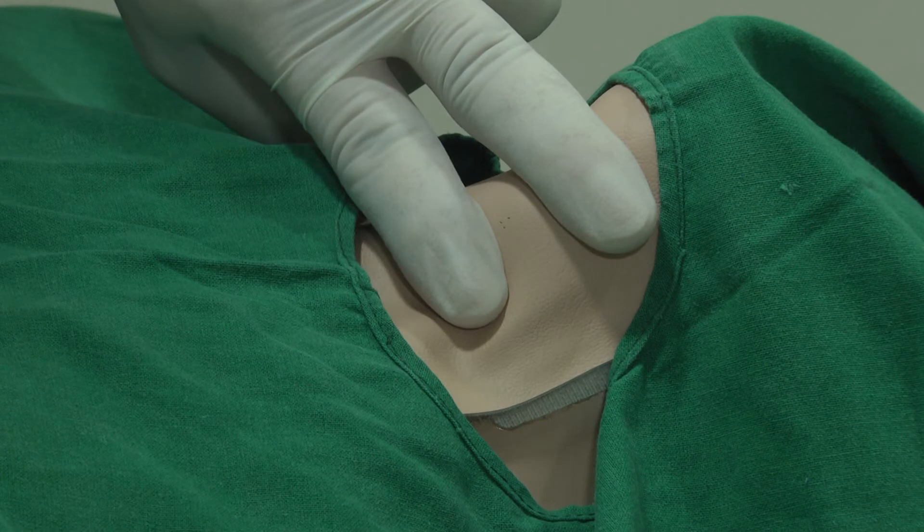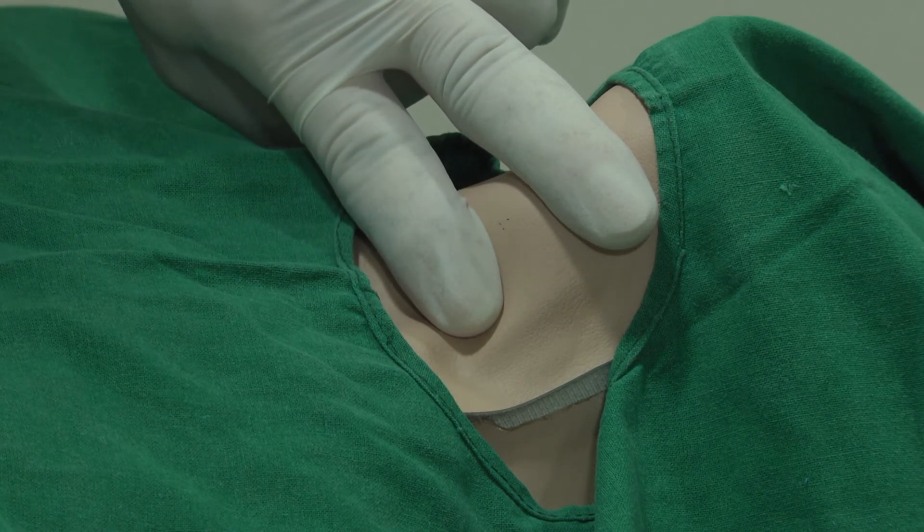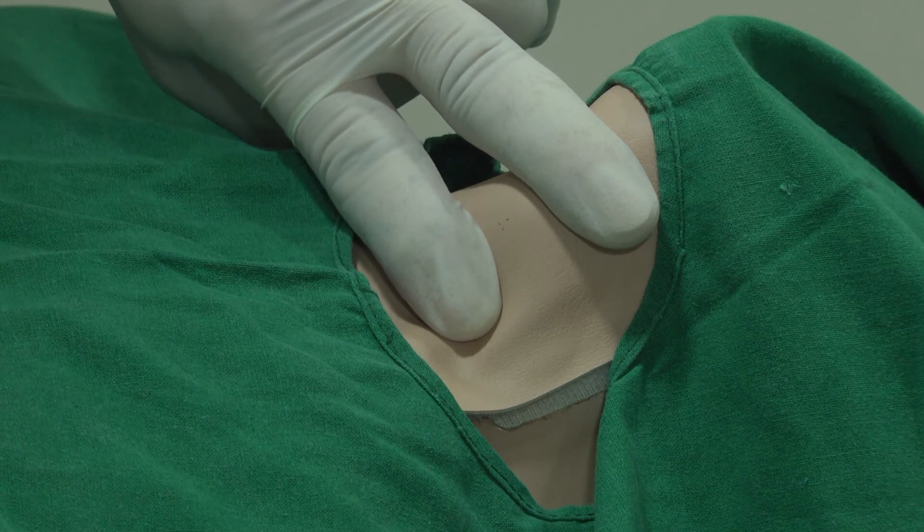A 2cc syringe can be used for the procedure. There are special devices available which can create negative suction. This can simply be done with a 2cc syringe as well.